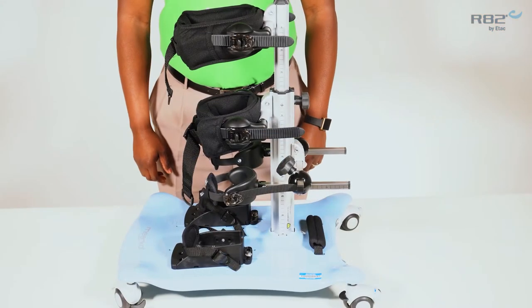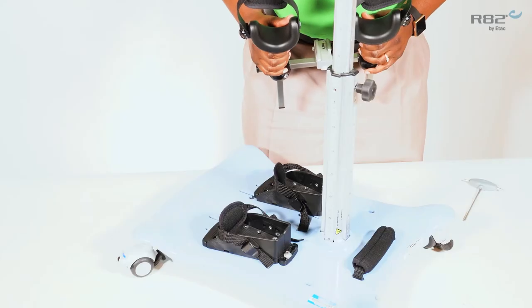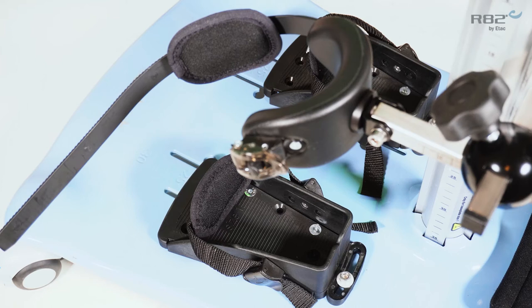The Meerkat is now set up for posterior use. Knee supports are an accessory for the Meerkat. The knee supports are available in 3 sizes.